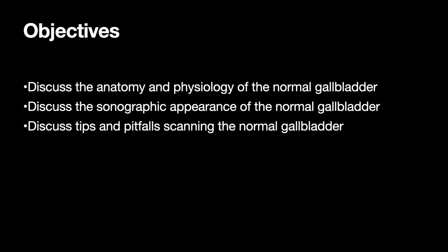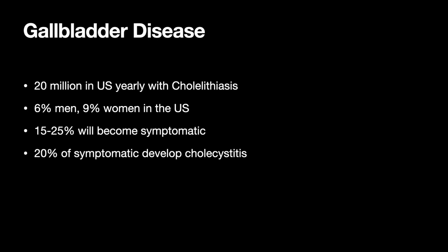And all this is going to set us up nicely for next time, when we can take this foundation that we're laying and say, okay, what normal looks like. Let's put some pathology in there, right? Let's see what that looks like and see how the gallbladder responds, and how we can then discover that with our ultrasound skills at the bedside for these patients, right? So that's the overview of today as we go from this patient presentation to a more specific application in the workup, right?